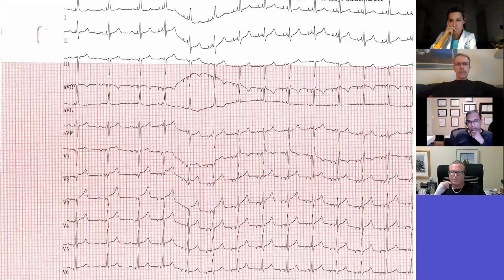Yeah, everyone calls this loss of anodal stim, like Huang and Padala and everyone. So the mechanism of going from the QS to the QR supposedly is that as you go down on the output and you're doing your threshold, you lose stimulation off of the anode, which is more susceptible because supposedly it's not selectively in the left bundle. Part of it may actually be sticking out. There are a number of different explanations, but whether it's true or not, the terminology people seem to use is the loss of anodal stim.